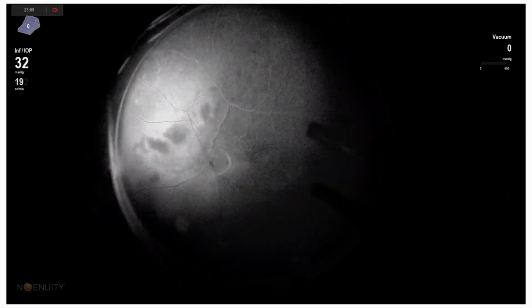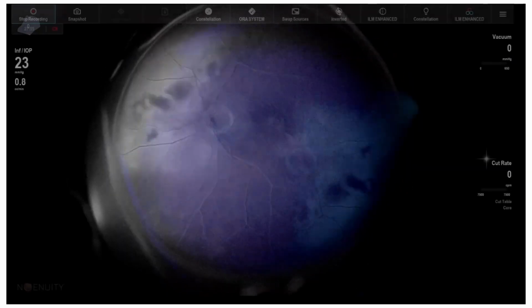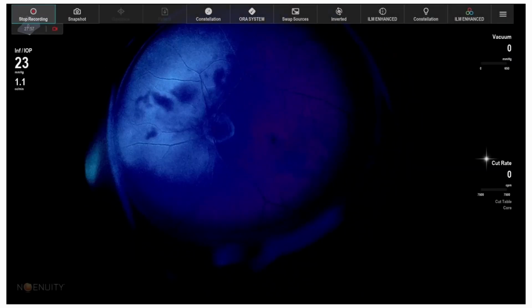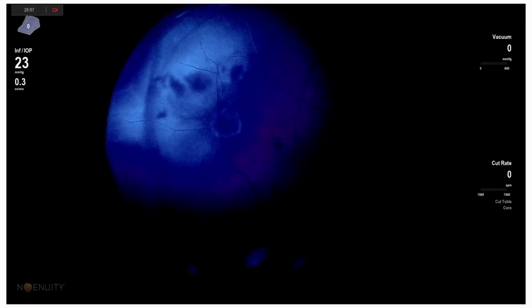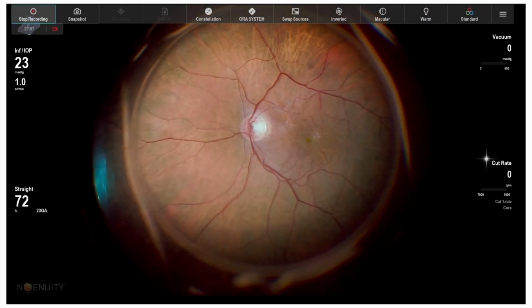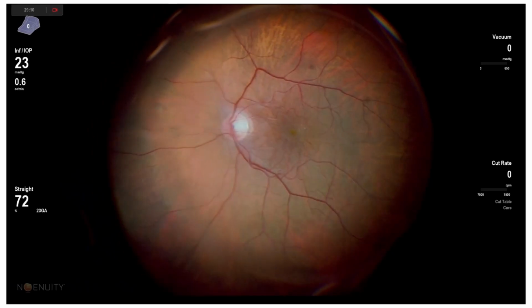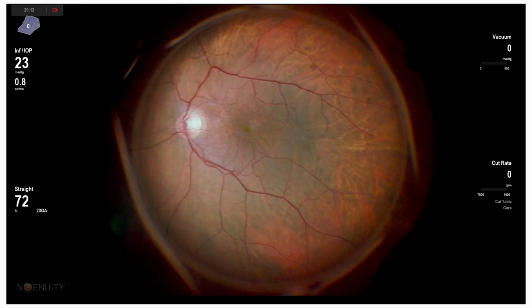Here I'm trying to show with the vitreotome where the area of interest is. Here it is, something really hyper-reflective. And here, blue reflectance. So apart from non-perfused areas, it seems that it's possible to see inflammatory areas, because here, again, this is the normal fundus view, and we don't suspect that anything is behind this. Behind it, we later on found that there were tuberculosis antibodies.